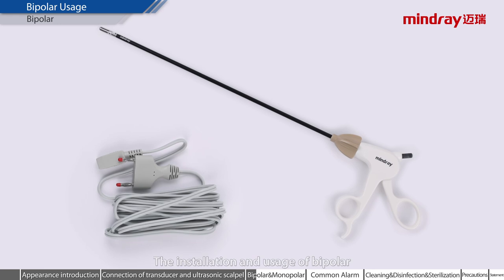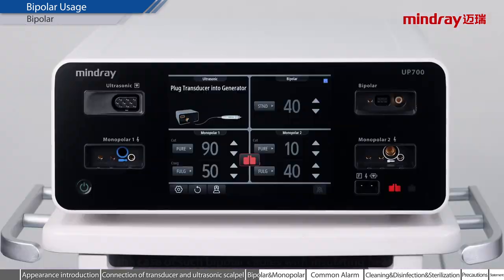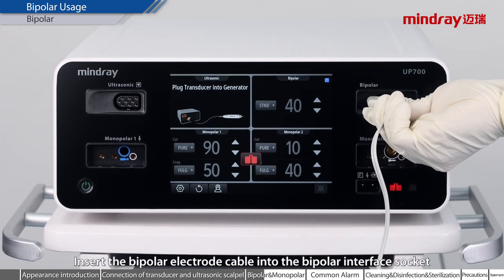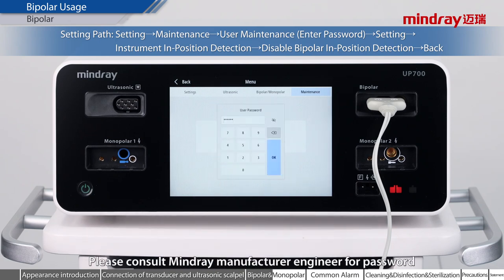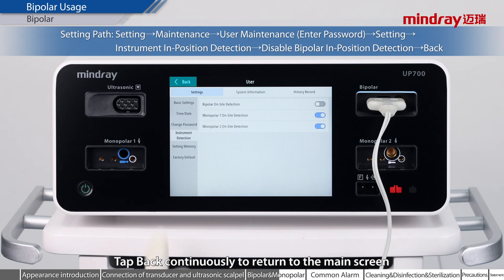The installation and usage of bipolar. Install the bipolar electrode cable with the bipolar in place. In the case of bipolar cables with insulating heads, the bipolar device presence detection function must be disabled. Insert the bipolar electrode cable into the bipolar interface socket; the in-position indicator does not light up. Click Setup, then Maintenance, then User Maintenance. Please consult Mindray Manufacturer Engineer for the password. Click the device presence detection to disable bipolar in-position detection. The bipolar indicator is then on. Tap Back continuously to return to the main screen.